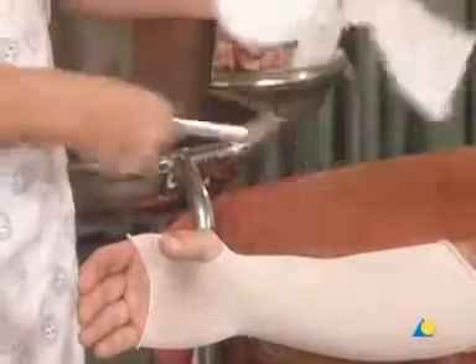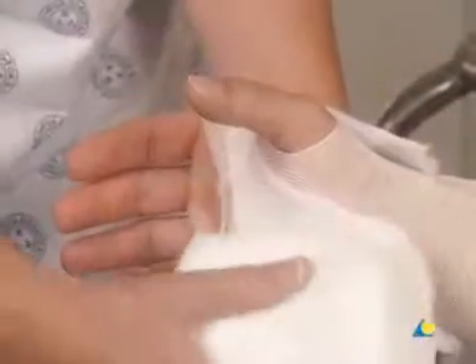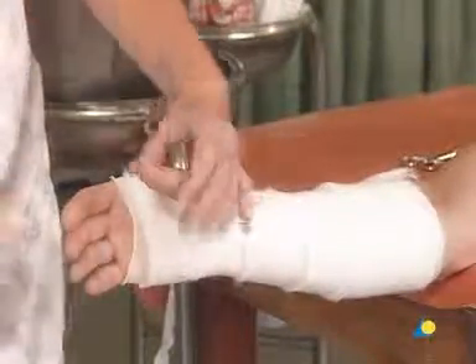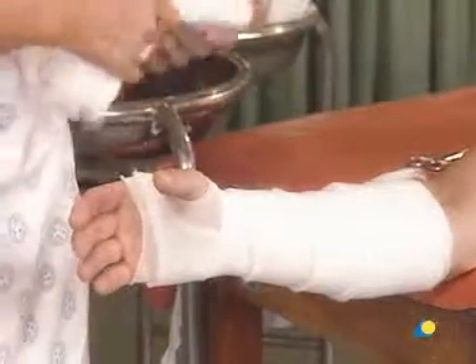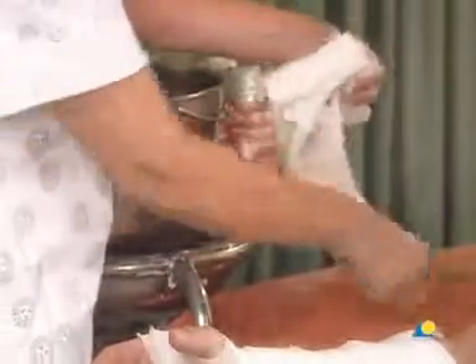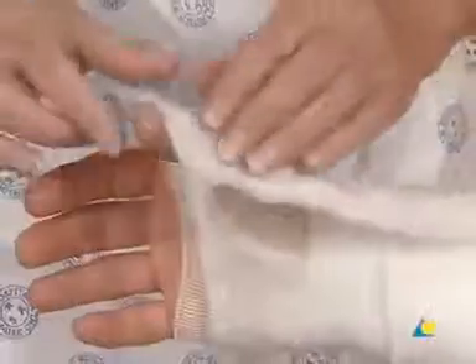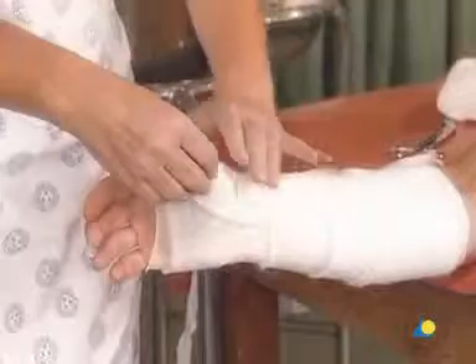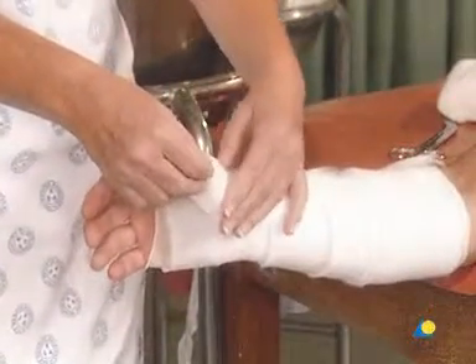The cotton wool is used for undercast padding, with a slit cut for the first web space. It is gently wound around the forearm with a 50% overlap to create a double layer of padding. The cotton wool extends beyond the planned edge of the cast so that when the end of the stockinette is folded down, the cast will be padded. An additional piece of cotton wool is cut and placed over the thumb to protect the styloid of the radius and the base of the first metacarpal from pressure points.